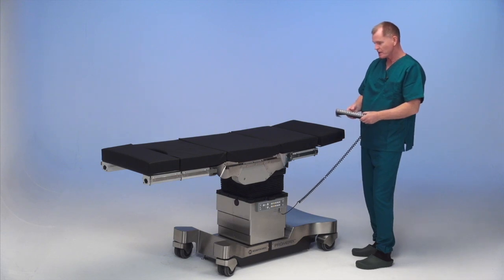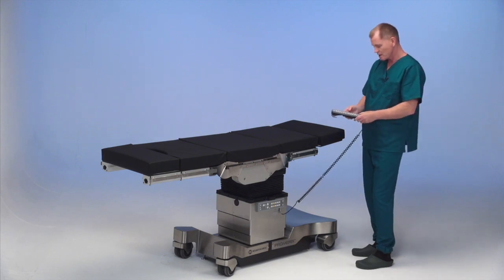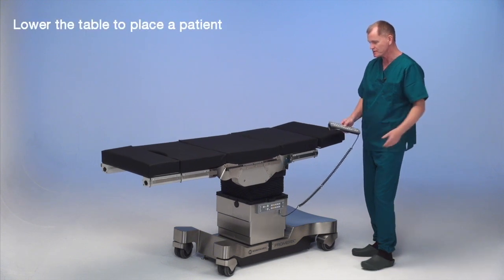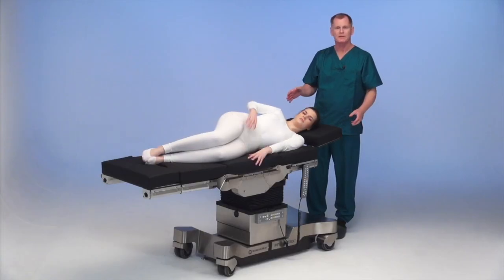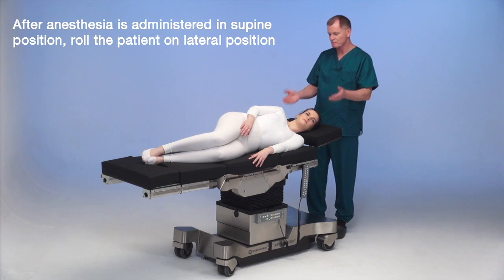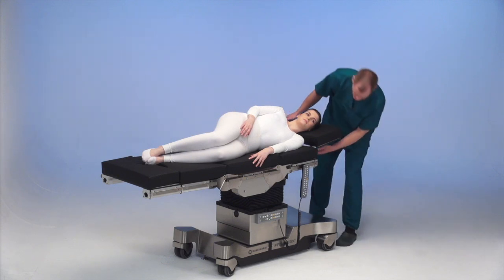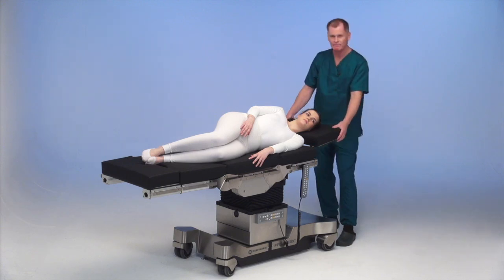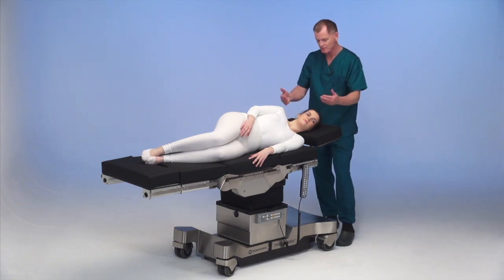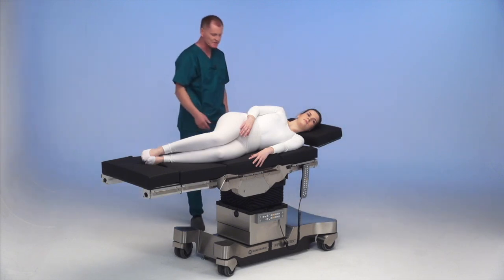We have the table set up now at the proper length for the patient to be positioned. I'm going to lower the table down to place the patient on it. Anesthesia is administered in the supine position and then we roll the patient onto their side. We then adjust the dual articulating headrest up to meet her neck so her neck is straight and she's in a safe position.